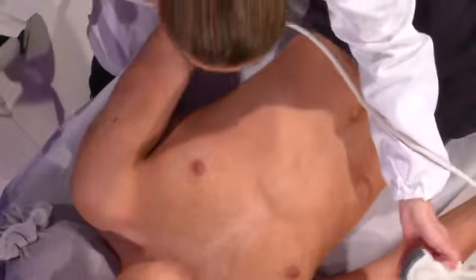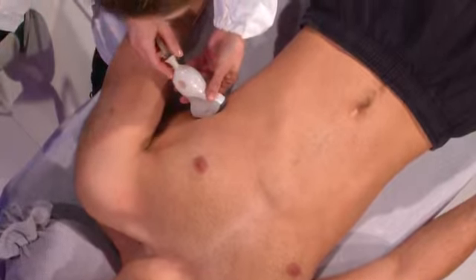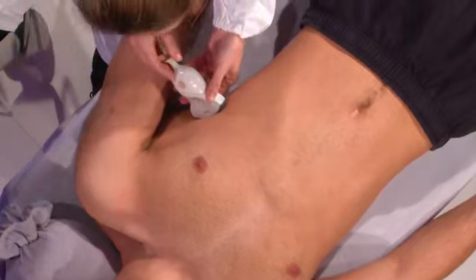There is also an extended version of the FAST protocol, which is the E-FAST. And in the E-FAST, you also scan, again, the right costophrenic angle, like this, and the left costophrenic angle, like this, as we have seen before. And very important, you can also scan your chest to diagnose or exclude the presence of the pneumothorax.